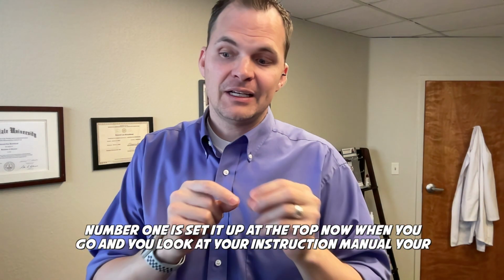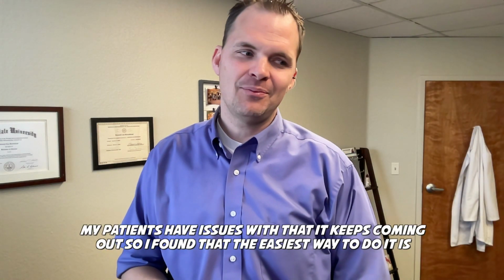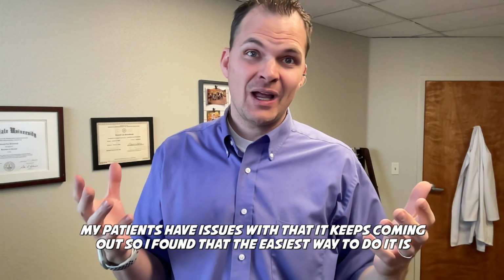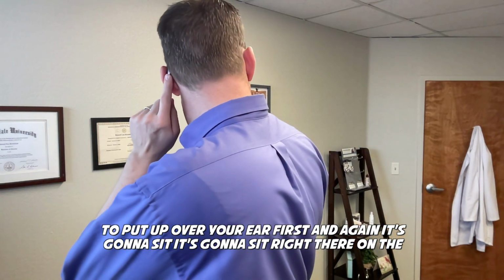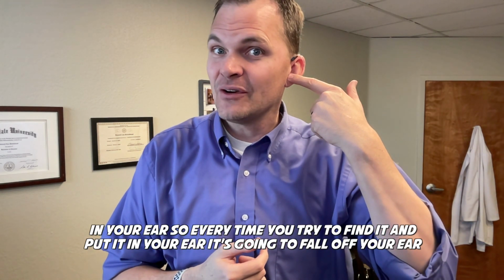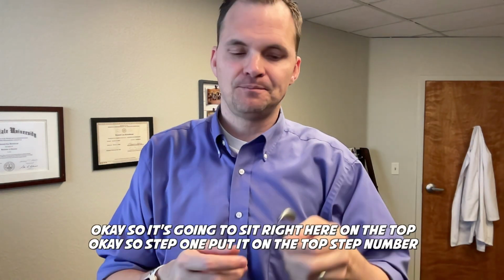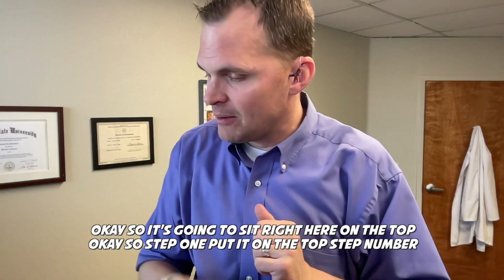Now when you look at your instruction manual, it's going to say put it in your ear first and then flip it up over your ear. My patients have issues with that. It keeps coming out. So I found that the easiest way to do it is to put it up over your ear first. And again, it's going to sit right there on the top. If you're pulling it back too far, then that speaker right here is not going to be ready to go in your ear. So every time you try to find it and put it in your ear, it's going to fall off your ear. Okay, so it's going to sit right here on the top. So step one, put it on the top.